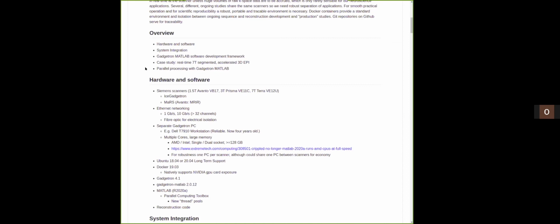And then one issue has been that these recons can be quite slow, and Matlab has a reputation for being slow. But I've done a lot of work using the parallel processing toolbox, and I'll show how that can be very nicely integrated with the function composition framework that Christopher showed earlier, and that the other guys were using as well in their application talks.